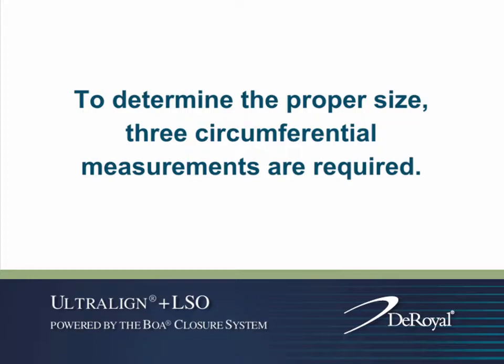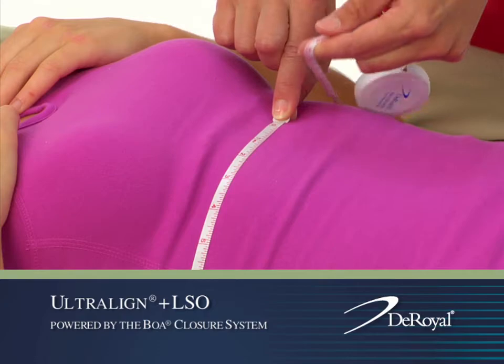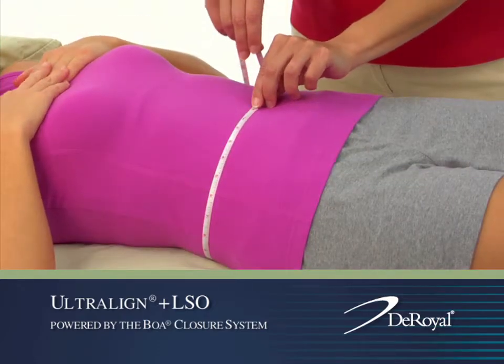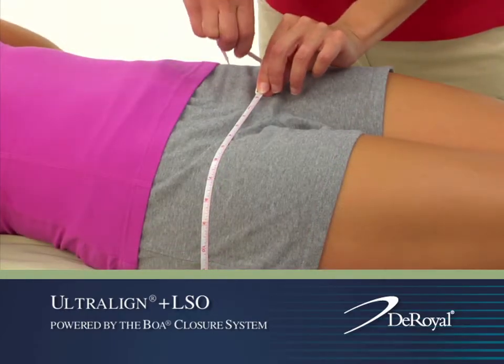To determine the proper size, three circumferential measurements are required: the xiphoid or chest, measuring one inch below the tip of the breast bone; the umbilicus or waist; and the greater trochanter, or fullest contour of the hips.